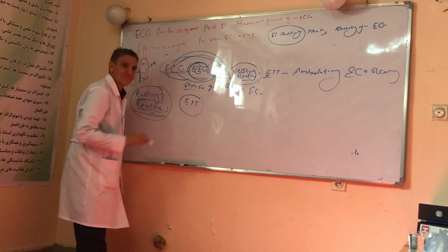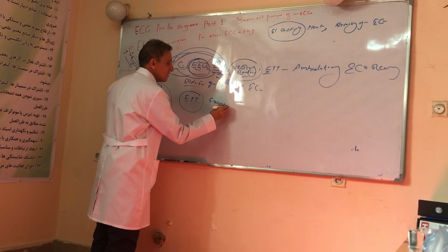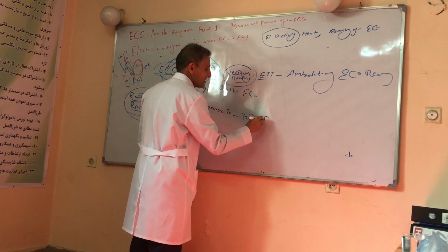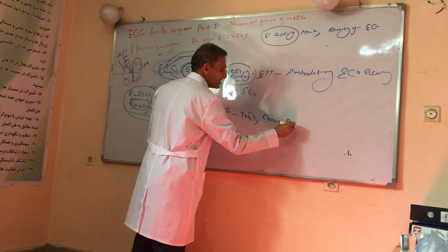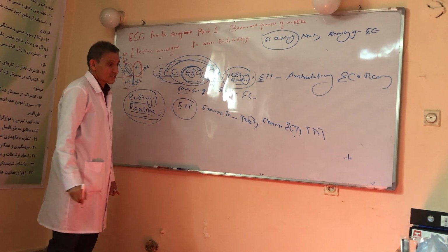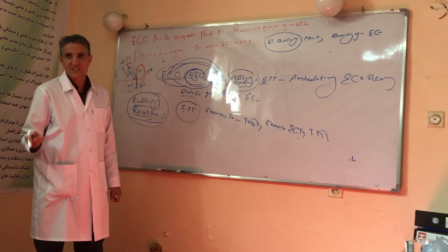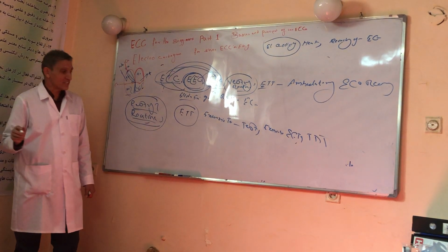What is ETT, or exercise tolerance test? Other names: exercise ECG testing, or treadmill test. I have already discussed that resting ECG is an ECG that we take without asking the patient to exercise. All those ECGs that we take in our clinical practice are resting ECG.